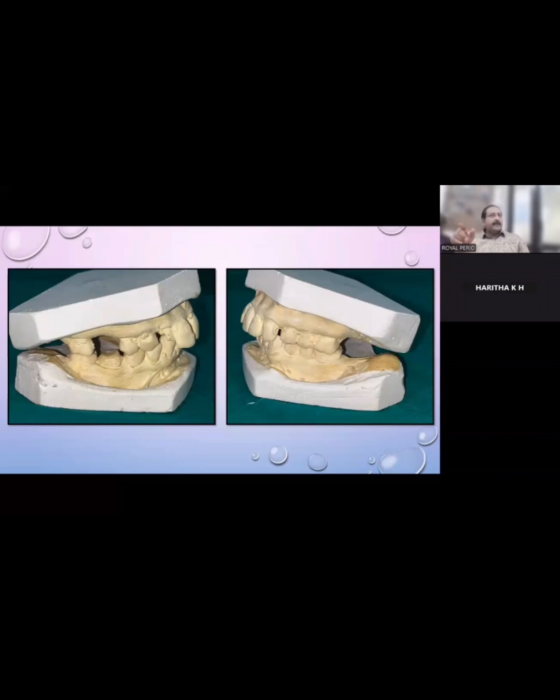The radius is 2.2. Take it as 2.5. So 2.5 plus 3. Am I right? Yeah, 5.5. Since you're extracting that premolar, you've got lavish area over there. So it should be 5.5 or 6 millimeter away from the 1/7 cervical region. So in the cast, you will measure it and confirm how much it is, whether it is 1 or 1.5 or 2. That has to be added with the radius of the proposed implant.